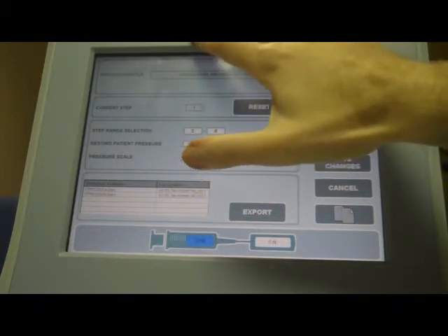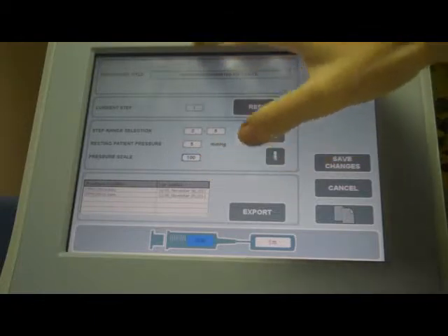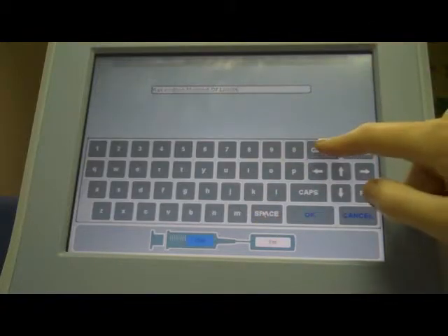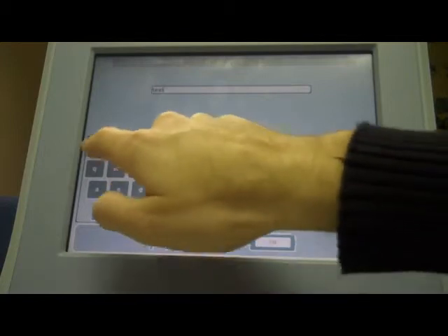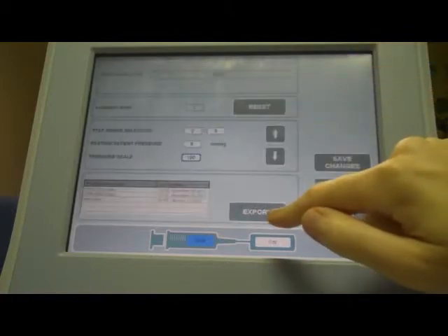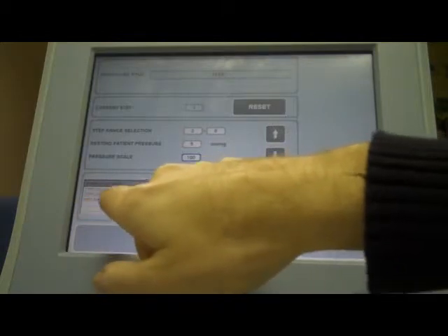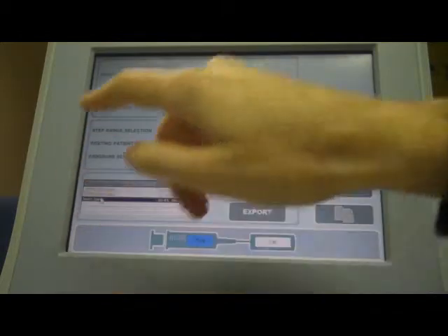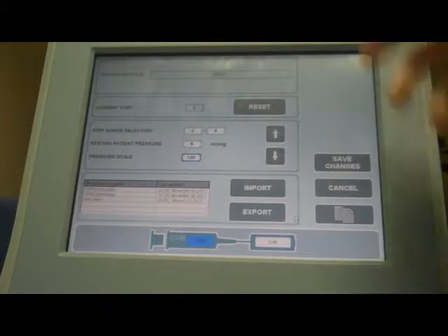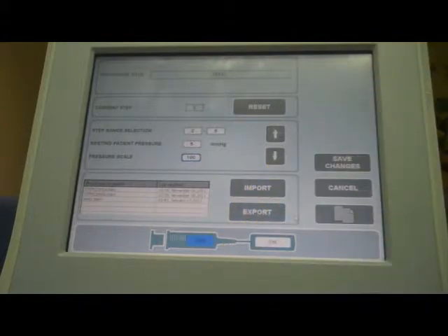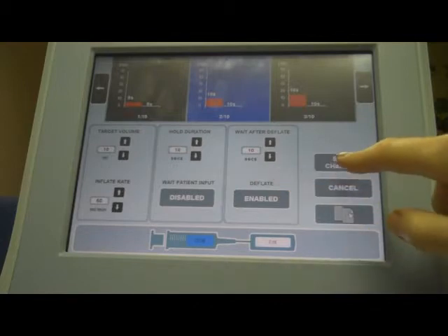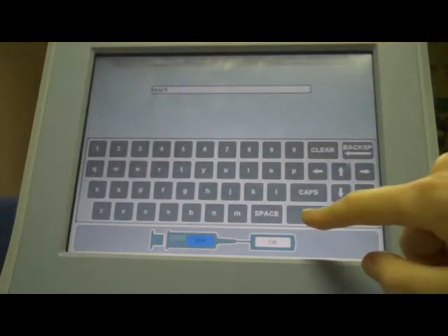At the bottom, you have options to import procedures you've already saved or to export them. If I press the export button, it asks me for a title — I'll enter 'Test1' and press OK. It confirms it's been successfully exported to the key and I can see it listed as Test1.barrow. To import, I press the import button and confirm — it's now imported. I can carry this USB key to another unit and import the procedure so I have the same configuration everywhere. When you're finished configuring, press the save changes button, save the name of the procedure, and press OK.